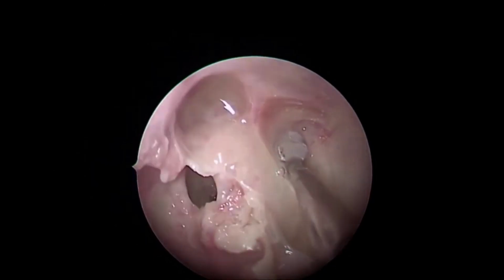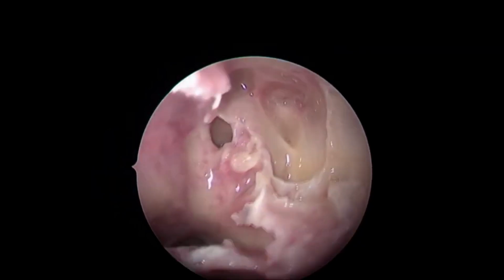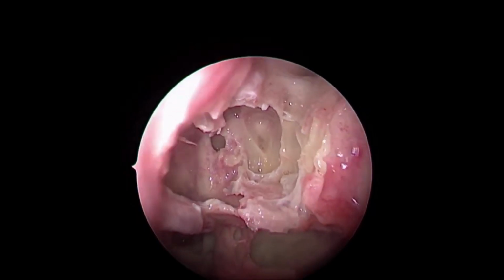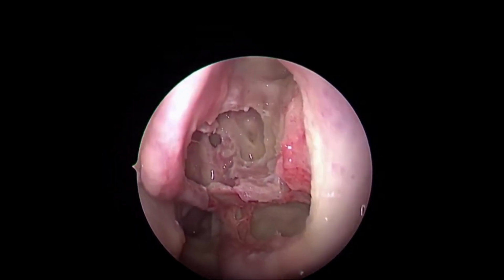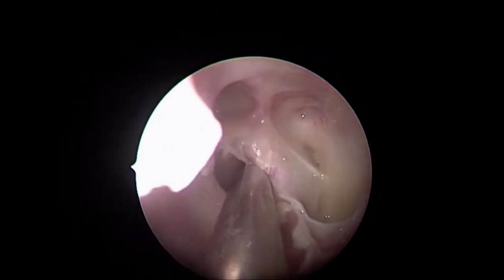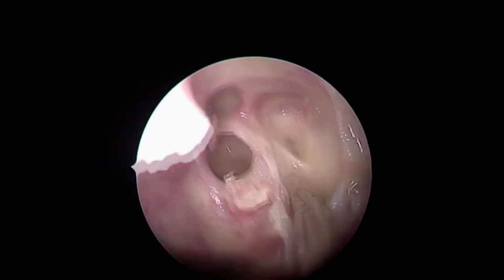This was described by Onodi, and this I have seen several times. Like we discussed last time when Professor Sethi was here, this is more prevalent among the Chinese population. Almost every other patient has Onodi. Not in India. In India, up to 20 to 30% we have seen. But this approach of going and seeing the sphenoid ostium first and then staying anterior to it can certainly avoid this mishap.